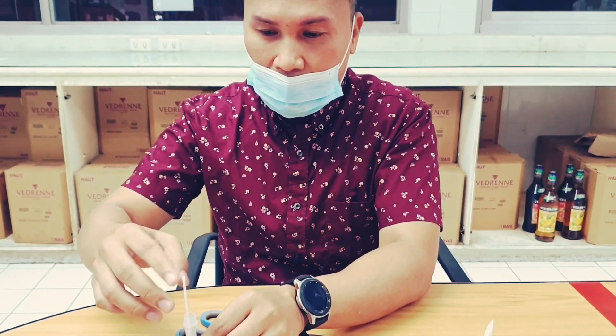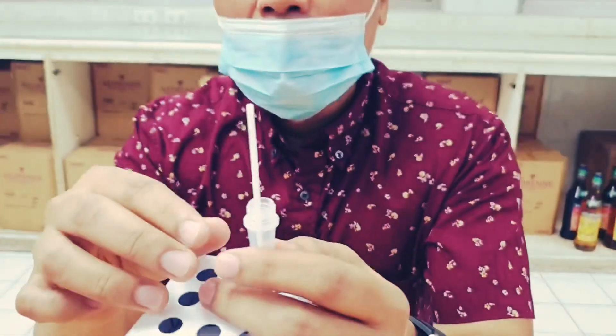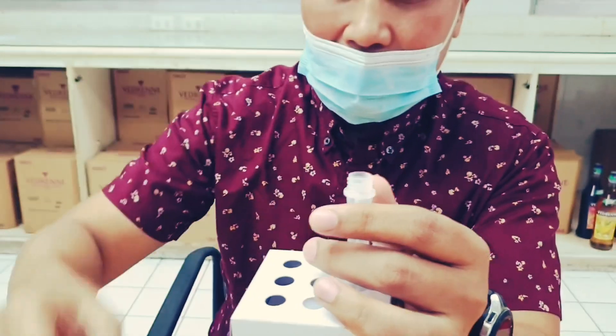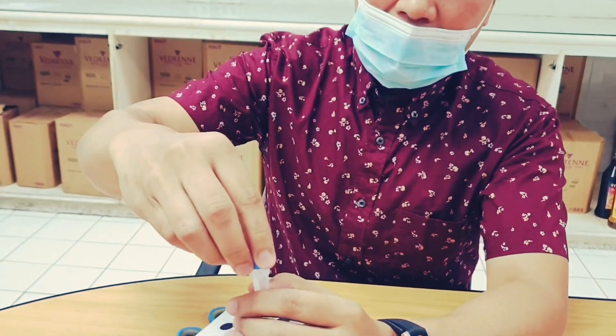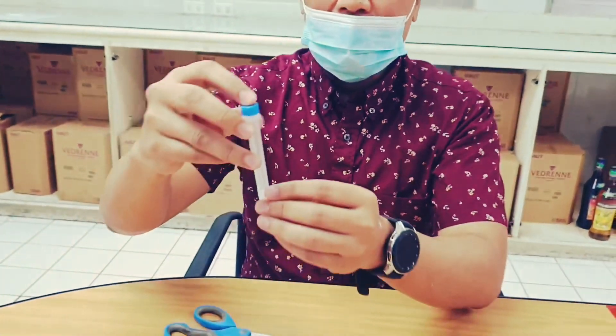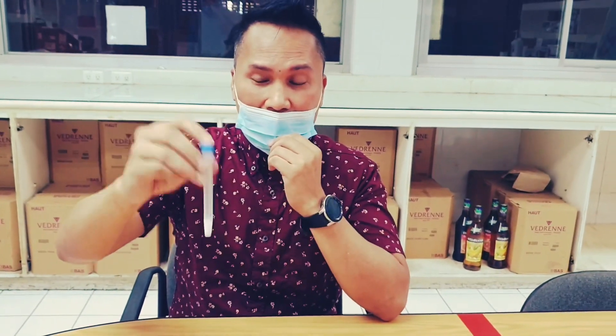Now put the swab inside the tube. Cut the excess portion of the swab stick, close the tube, and then shake it for a few seconds.